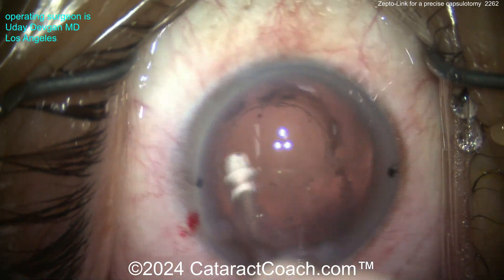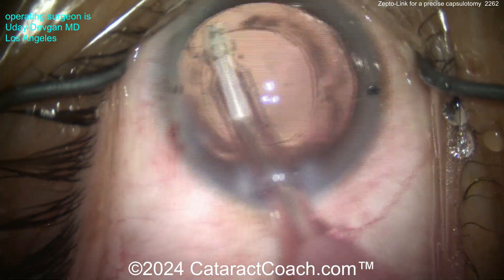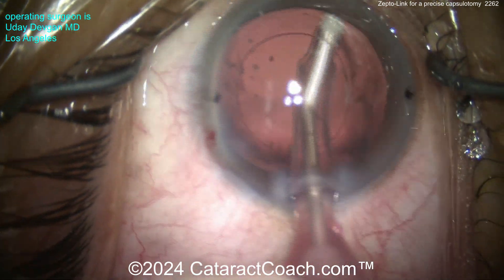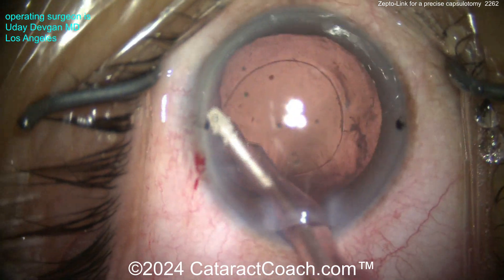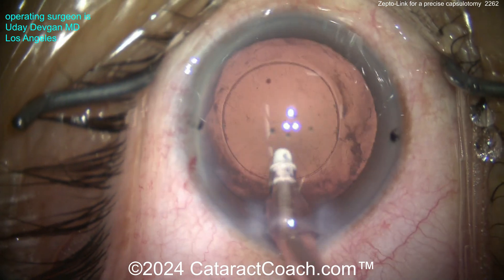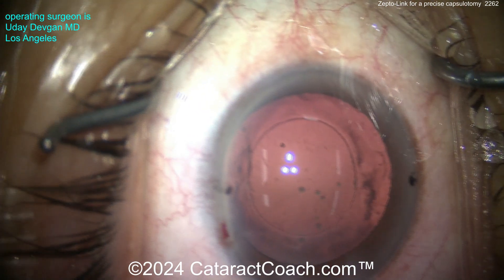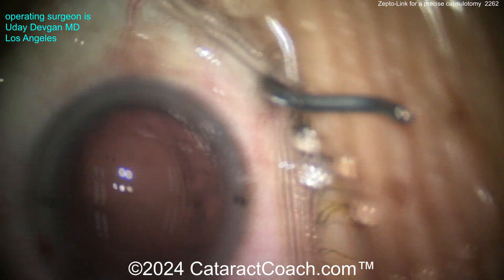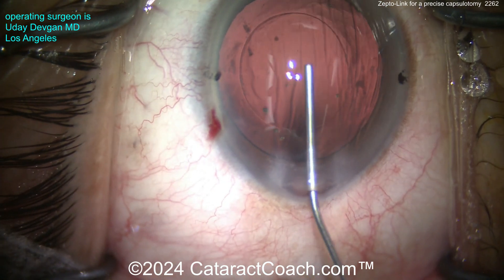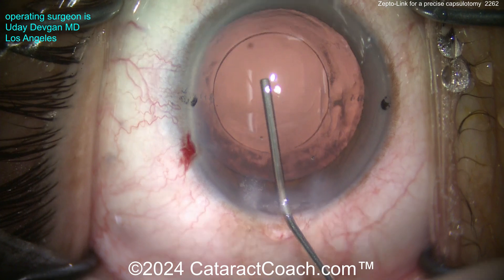When you clean up the cortex, everything looks pretty good — nicely cleaned up. The backflush from the Zepto device actually gave us a little hydrodissection too. Clean up the capsular bag here, vacuum and clean up the lens epithelial cells from the undersurface of the anterior capsular rim. You can see the capsulotomy opening — beautifully centered, very nicely done, perfectly round. Let's put in viscoelastic and do a little capsule polishing.